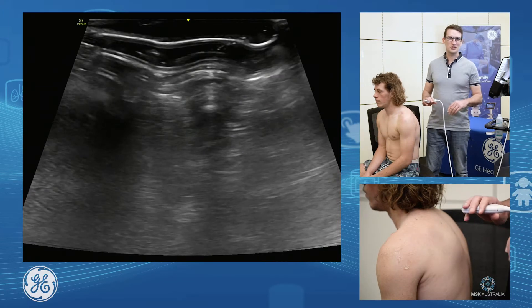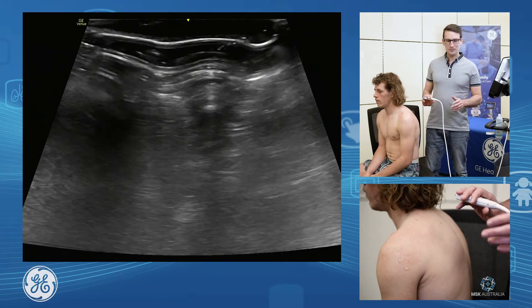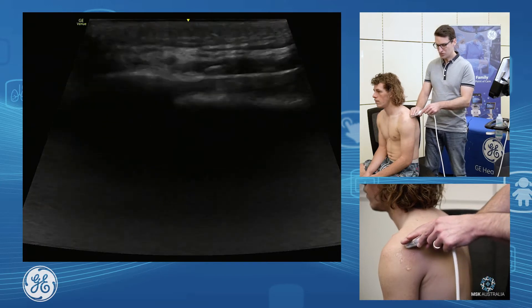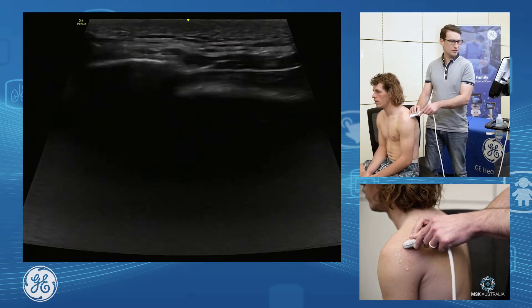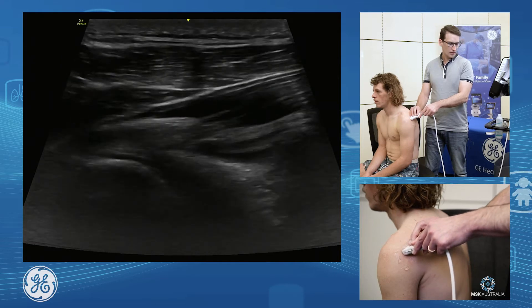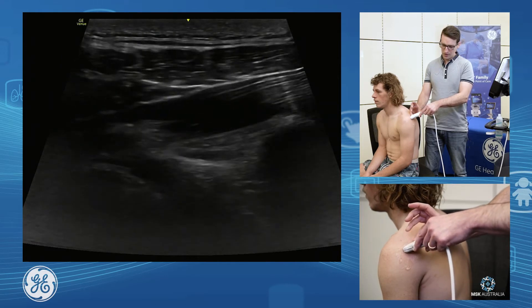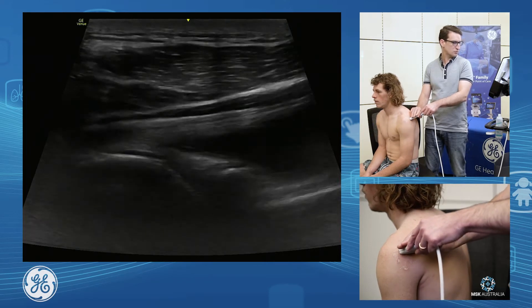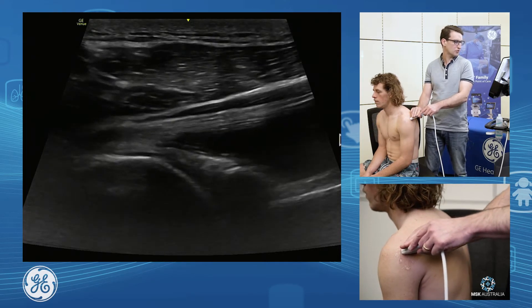I'm going to have a look at the posterior glenohumeral joint. The way we find this is we palpate for the spine of scapula, put our transducer on just inferior to that, and angle down inferiorly from there. I'm going to angle that medial edge of my probe inferiorly just to get a nice plane through that glenoid and humeral head.